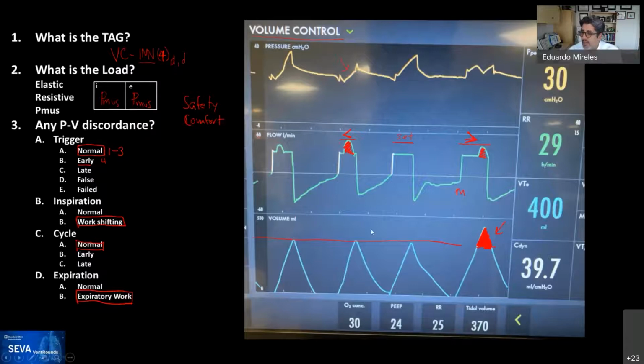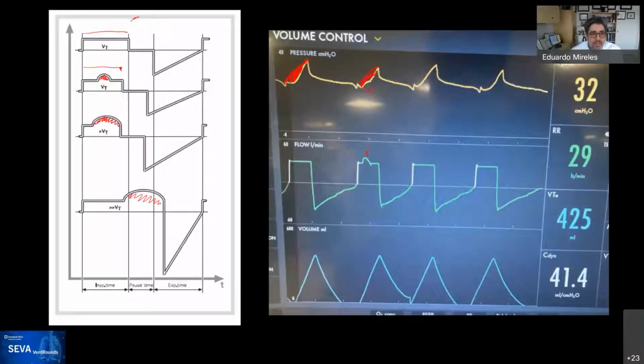Rob, any comments here? Nope, you covered it. Fabulously. So really interesting and a good example of dual targeting and perhaps how you would be able. Any questions, comments?